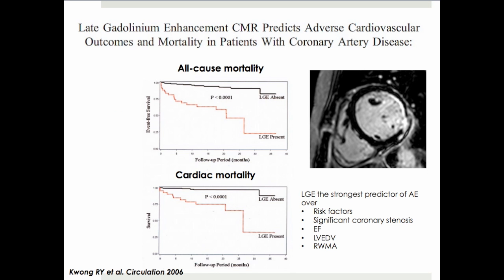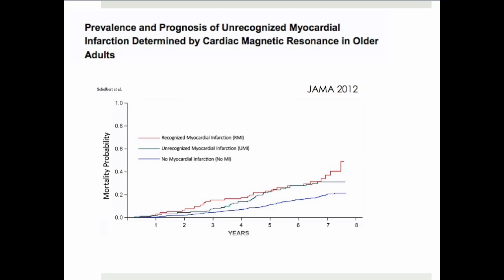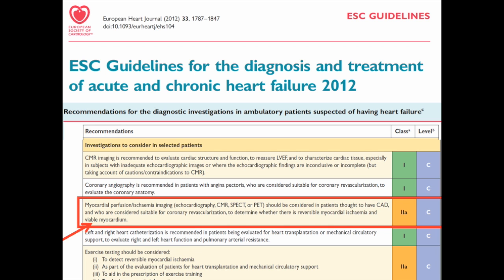Recognition of a previous myocardial infarction, however small, has bearings for prognosis, and this has been shown in a multitude of studies. Late gadolinium enhancement can guide clinical management by assessment of viable myocardium.